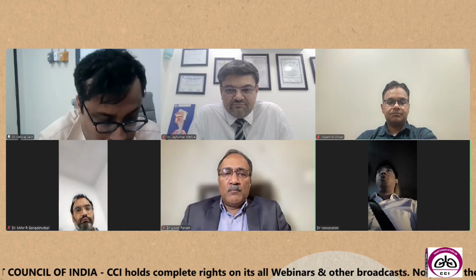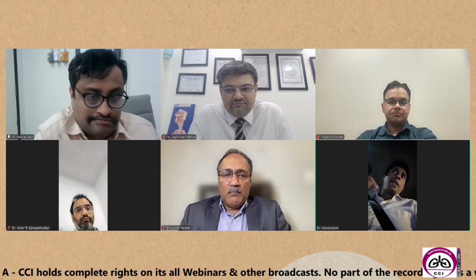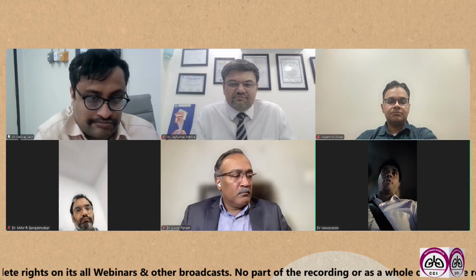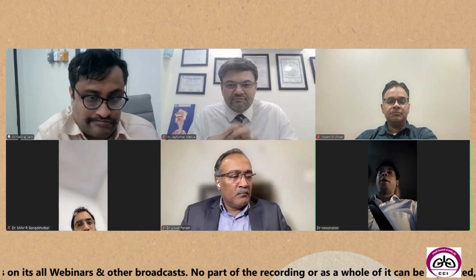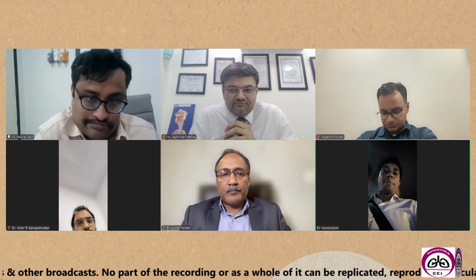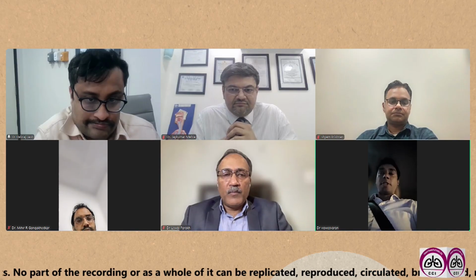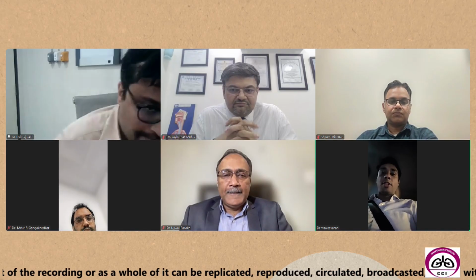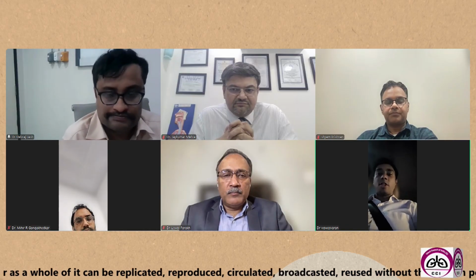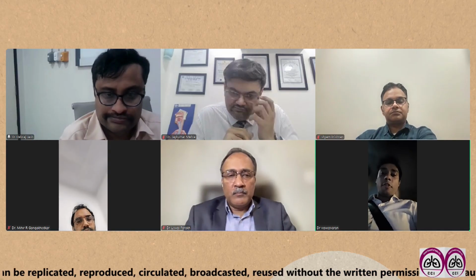It is not that you need to have only this sort of a scope to do a particular procedure. For example, the current center where I am practicing right now, we are doing more of Fuji because that is the instrument we have. But previously, I was working in the same organization in a different unit where I was using Olympus. It doesn't mean that my yield of the procedure, like the EBUS procedure, has changed or anything. We are getting the same yield. We are able to target the same station of lymph nodes. We are able to target the same centimeter size of the lymph nodes.